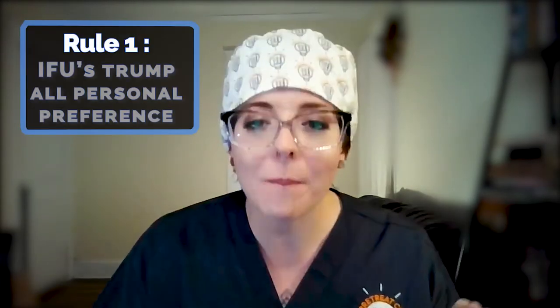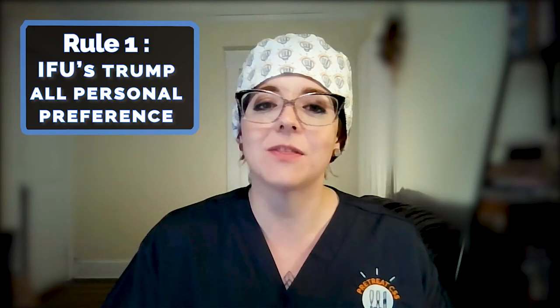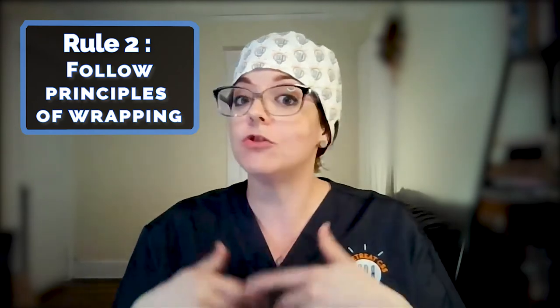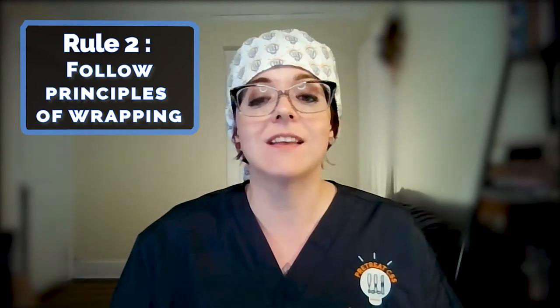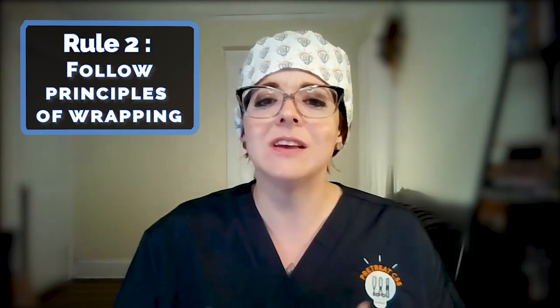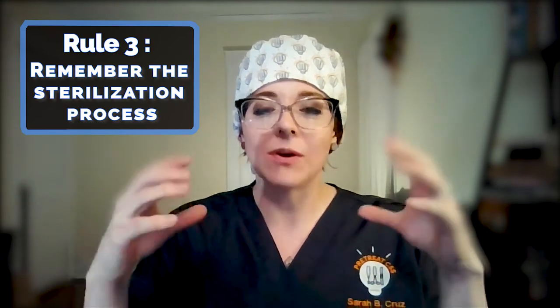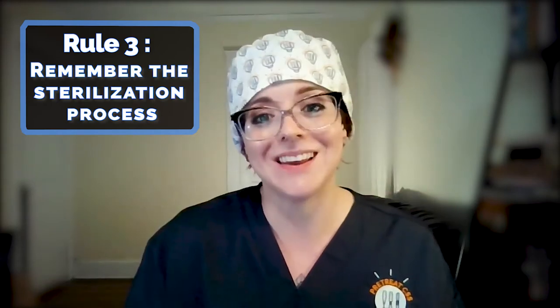Every wrap battle has some ground rules, so here are ours. 1. IFUs trump all personal preference. This includes the weight that the wrap's qualified to sterilize. 2. Follow principles of wrapping. Wrapping too tight may cause holes and even limit sterilant penetration. Wrapping too loose may cause moisture to get caught in the excessive material. It can also leave gaps where microbials can access our instruments. 3. Remember the sterilization process. The sterilization process of our autoclaves causes our wraps to expand and contract, so wrap accordingly.